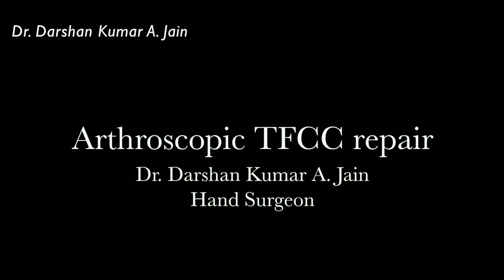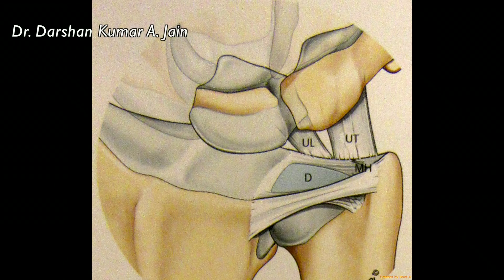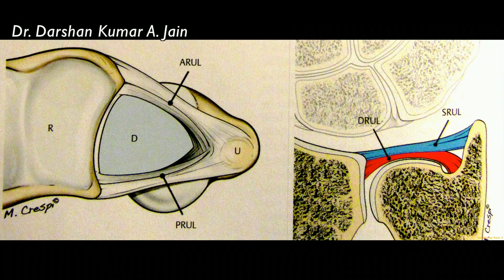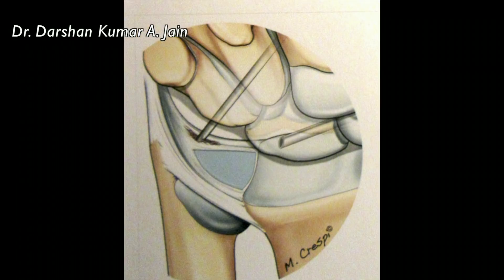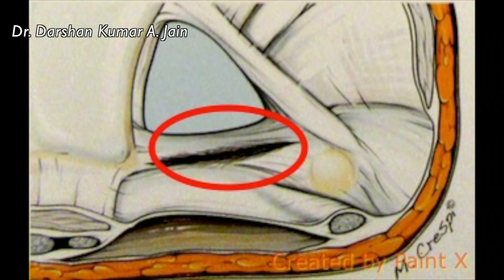I will be demonstrating the arthroscopic repair of the TFCC at the capsule. The TFCC is composed of the dorsal and the volar limbs along with the meniscal homolog, and it has a superficial and deep limb as well near the foveal insertion. The foveal insertion is one of the attachments which gets injured, and the other is the dorsal capsule — these are the two types which are commonly injured.